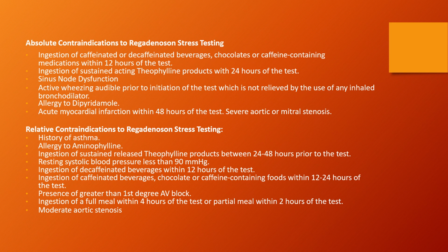So if you drink water and that water hits your stomach, your stomach knows something is in it and is going to start digesting it, and your stomach muscles are going to start working. If a patient has any water within 4 hours or so of the test, then their stomach is going to be working. The smooth muscle of their stomach is going to take up the rubidium. That can interfere with the test a little bit, even though PET imaging is much better at separating the anatomy. If the stomach is very close to the heart, it may overlap a little bit and that may interfere with the test.